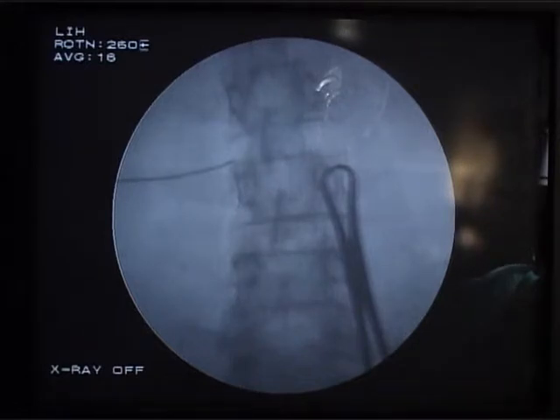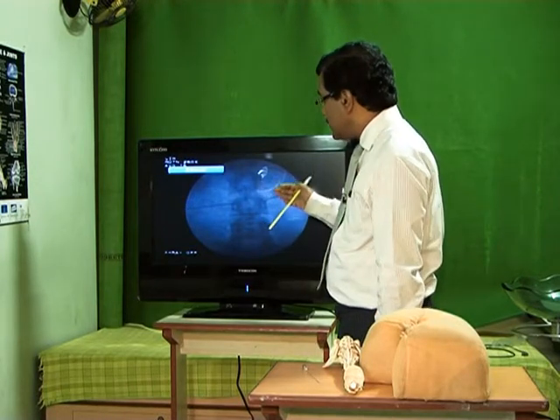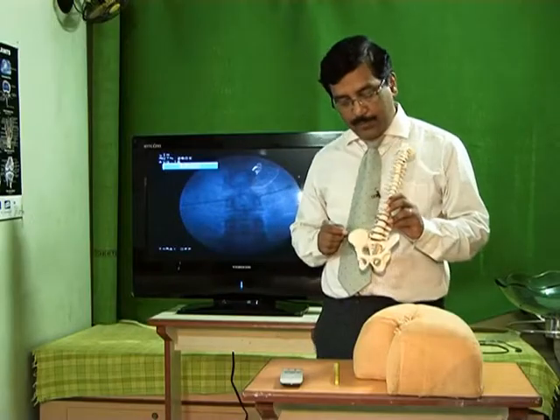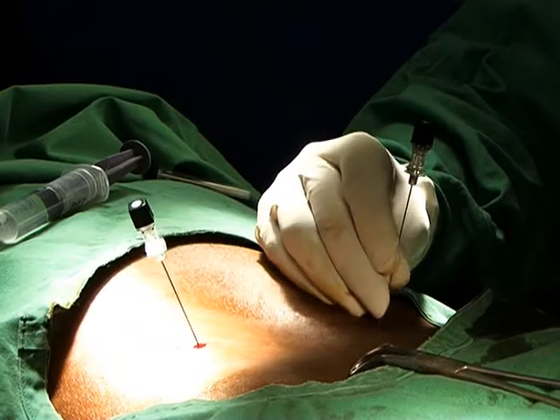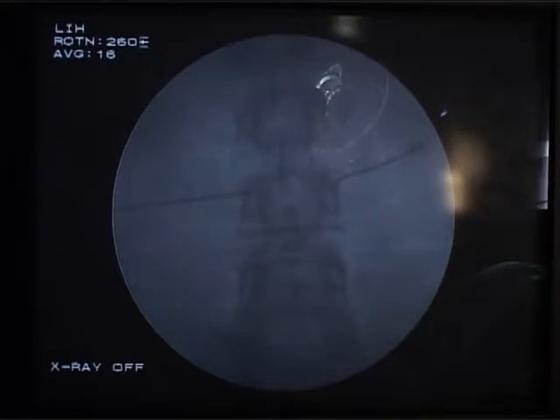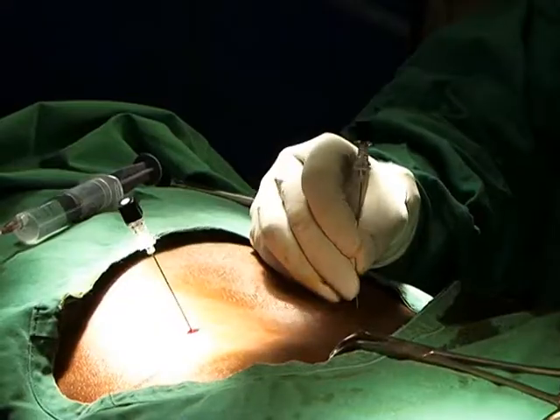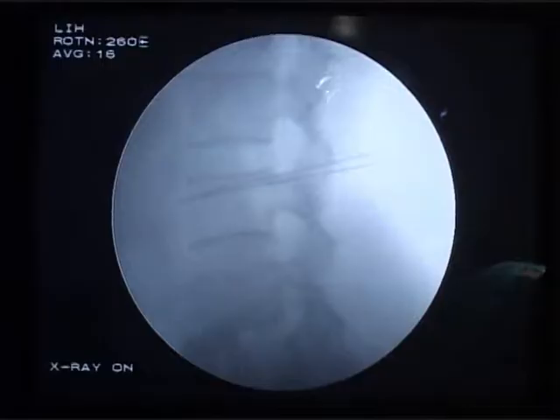This is the AP view of the lumbar spine. At the level of the L3 vertebral body, two needles are placed — one from the right side and one from the left side — at the junction of the lower two-thirds and upper one-third. Once the needle is placed and checked by AP view, the needle tip should just be crossing the lateral border. Checking depth by lateral view shows the needle at the junction of the lower two-thirds and upper one-third; however, the needle had crossed the anterior border of the vertebral body, so it needs to be withdrawn slightly.